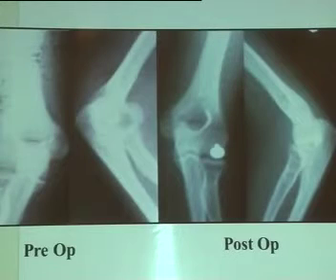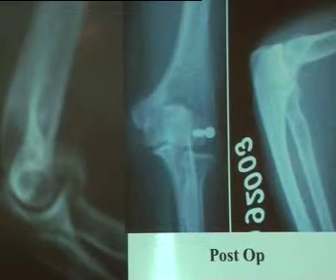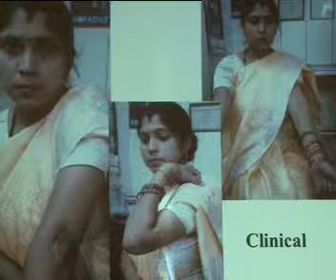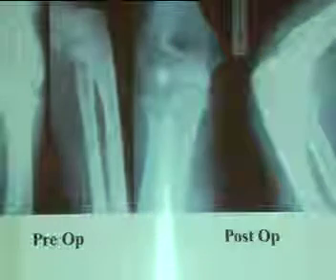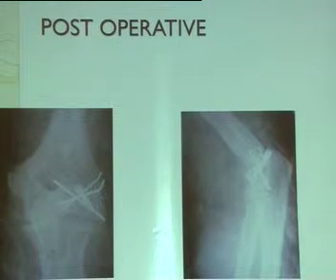I'll skip this. This is fixed with a single screw from posterior to anterior. The clinical results. The second case. Nowadays we use Herbert screws more. Another case. This is a type 4 fracture, a bad fracture, fixed with a Herbert screw and additional K-wires to supplement.